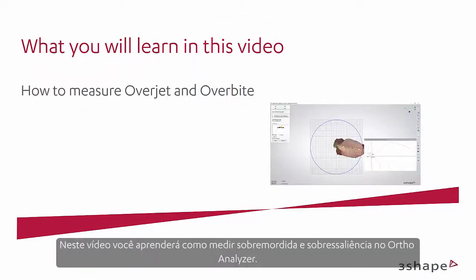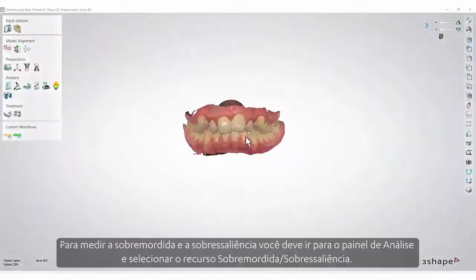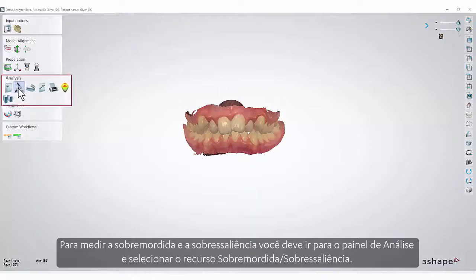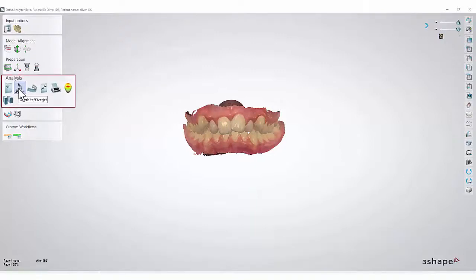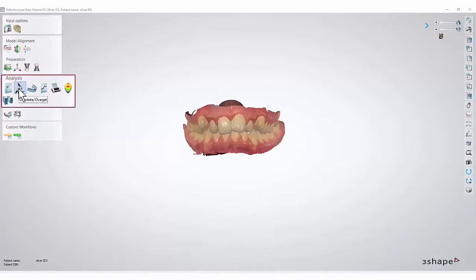In this video you will learn how to measure overjet and overbite in OrthoAnalyser. To measure the overjet and the overbite, you must go to the Analysis panel and select the Overbite Overjet feature. Make sure you have completed the segmentation beforehand.